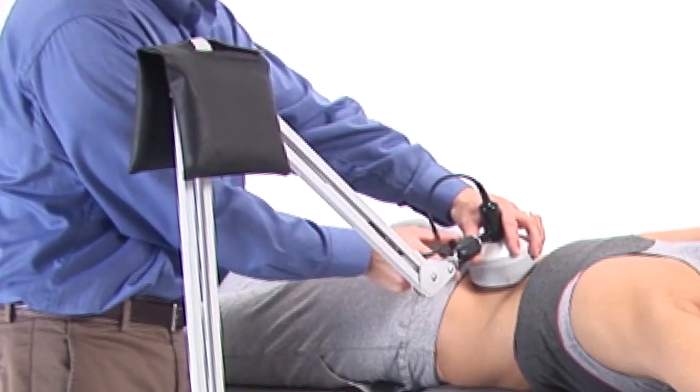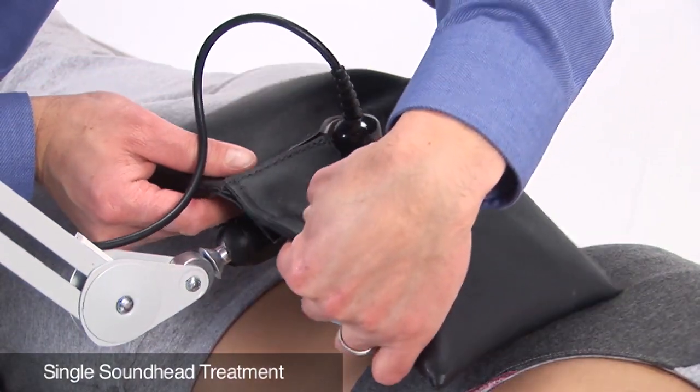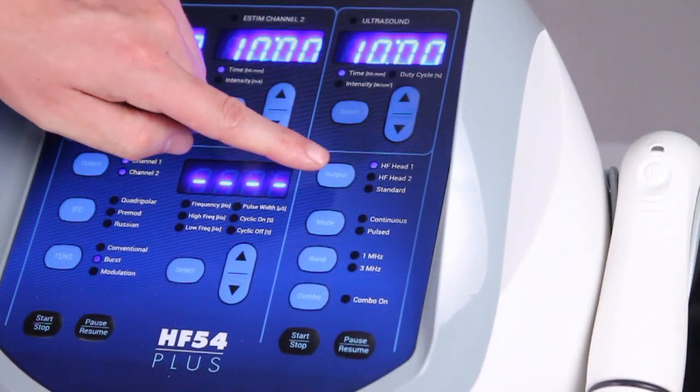The weight bag is used to improve contact to your patient. It can be placed on either the ultrasound arm or attached directly around the sound head.